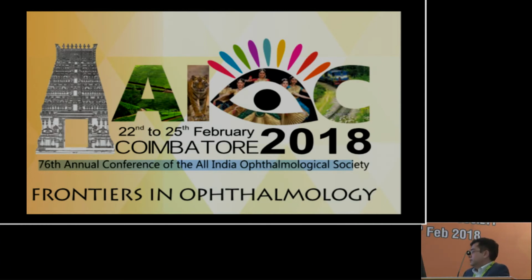True. Actually, RK scars we can see, but with post-LASIK patients, the ones who are coming in now, sometimes they don't want to tell in front of others, because they've not even revealed after marriage that they have had this procedure. So I always have a good look at the K reading, and if the K is flatter than you would expect in a normal person, because the LASIK scar sometimes you can't see on the slit lamp, we just have to take a good history from the patient.